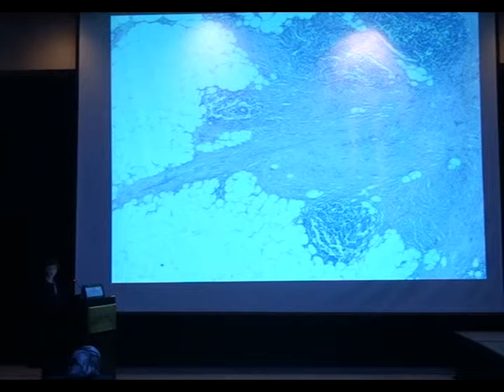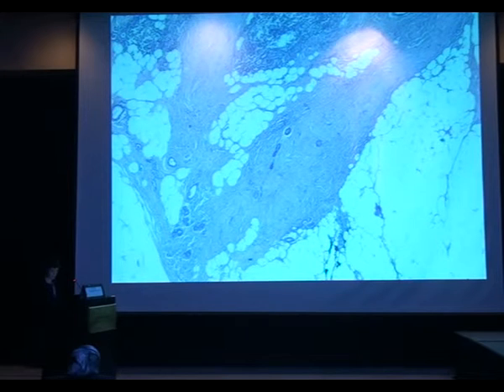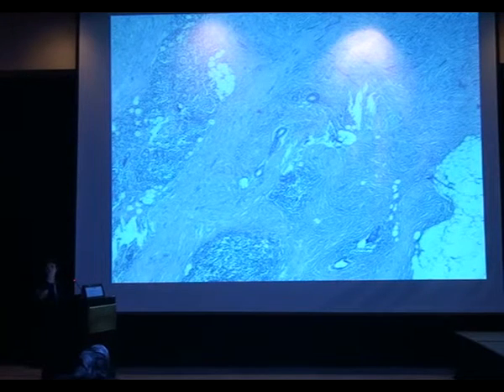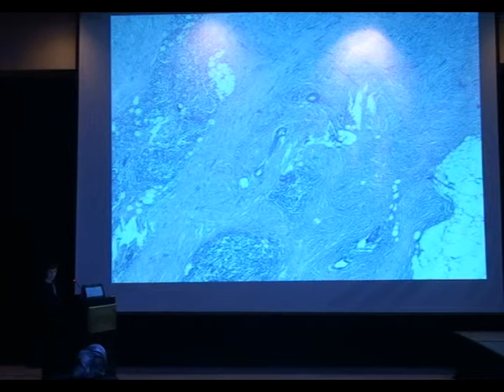So we have a kind of fibromatosis aspect with peripheral lymphocytic nodules, kind of collagen bands and fibroblastic tissue, with entrapment of the adipose tissue. And then you can see from some parts that you can have some glands that are also present. So you go to higher magnification, and you see that it's not a fibromatosis. It looks like a fibromatosis, but if you go to a higher magnification, you can see that you have some areas with glands, some areas that are cellular and that look from this magnification with bigger cells, like cords of cells.